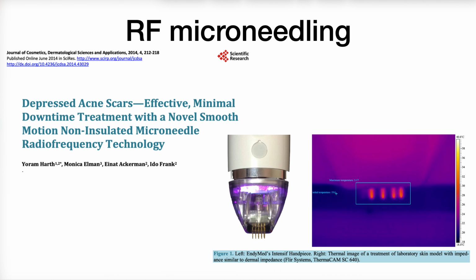RF microneedling is a technique with characteristics comparable to laser therapy, with an advantage of delivering heat at greater depth and in a gentler way.